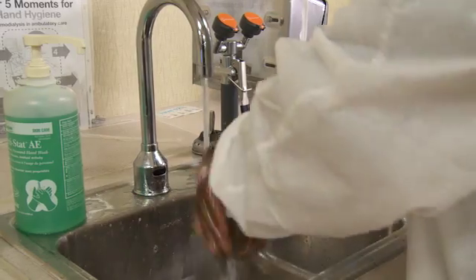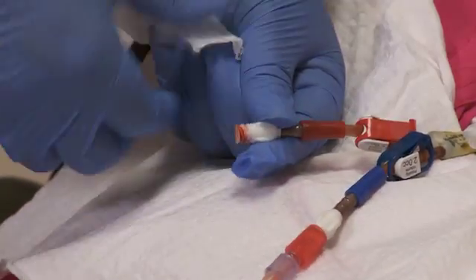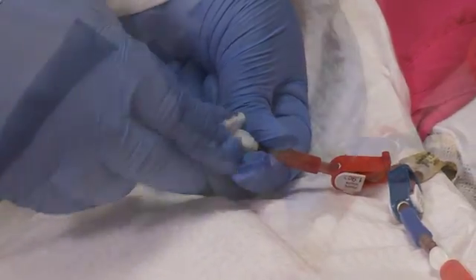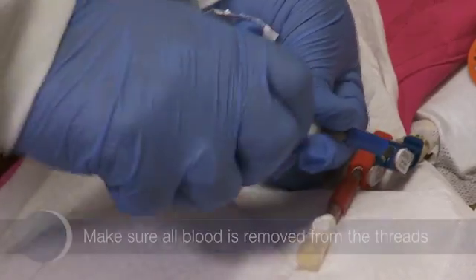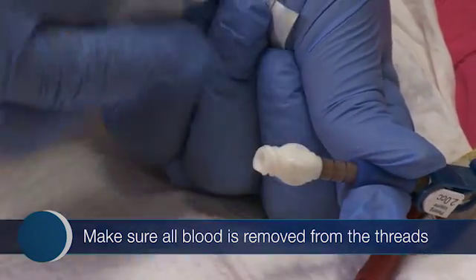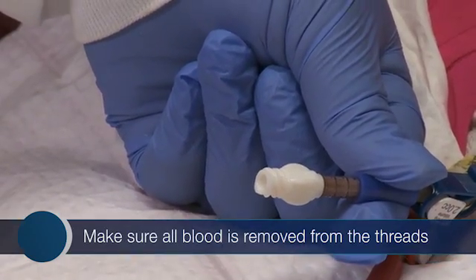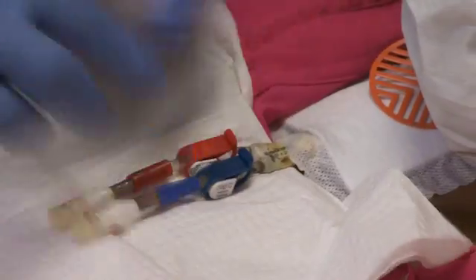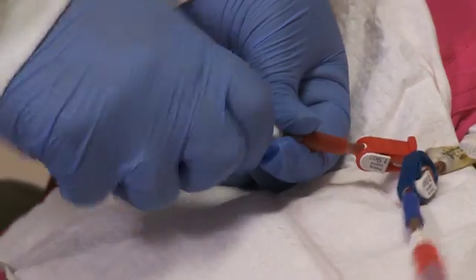While wearing other appropriate PPE, perform hand hygiene and put on a new, clean pair of gloves. Make sure to clamp the catheter and then disconnect the catheter from the bloodlines using aseptic technique. Apply antiseptic to the ends or hubs of each catheter using a new sterile antiseptic pad for each hub. Scrub the end and sides of each hub with friction, ensuring that all debris is removed. Let the catheter limbs and hubs air dry naturally. Do not touch the cleaned hubs and do not set the hubs down. Attach new sterile caps using aseptic technique and remove your gloves and perform hand hygiene. You should scrub the hub any time there is a line disconnection or reversal. Following the scrub-the-hub protocol and paying close attention to aseptic technique will help prevent bloodstream infections.